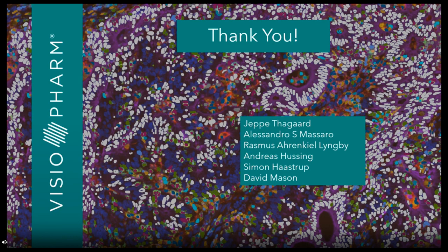So there is no special requirement other than the classical ones that you would have also for any other IHC staining. So you want to have slides that have been cut recently. You don't want to have epitope degradation before you perform the staining. So you need to pay attention to your slides, but also, most of it is done at the very initial phases when you collect the samples and the way you embed them, the way you preserve them, which is something typically done and taken care of for any type of staining. So the short answer is that no specific requirements are there, and we can work with very small tissues as well.